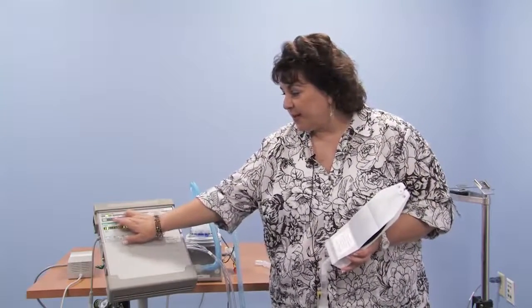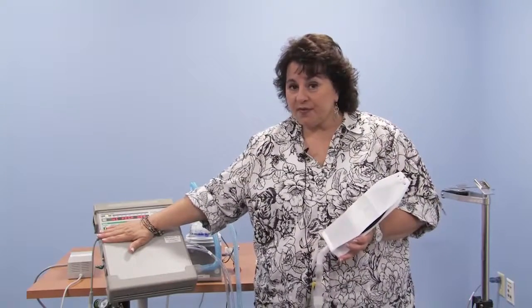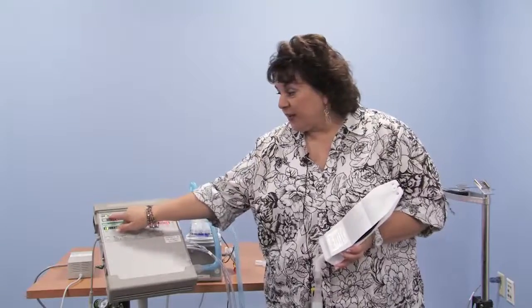This will look the same. This will look the same. The PIP will be the top number, the 20 or the 15. And that's what you'll see on the airway pressure, because that's what your child's receiving. Up to 20, down to 5. Up to 15, down to 5. Those are the prescribed pressure settings so that your child achieves the right size of breath for their condition.